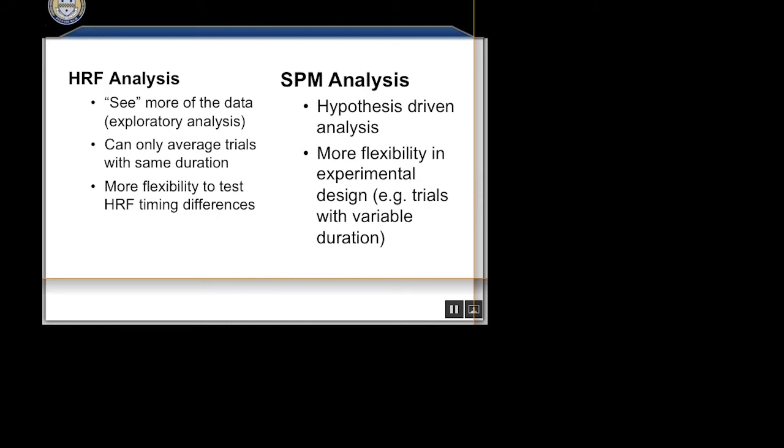And it looks at this as a function of the duration of the task. What it turns out is that if your task is longer than about 10 seconds, it doesn't matter anymore. Because of the shape of the hemodynamic response, where it goes up and peaks, as in the last couple of slides, if I shift the response or have a slightly different response, it affects the transients, that is, the very early seconds and the very late seconds.